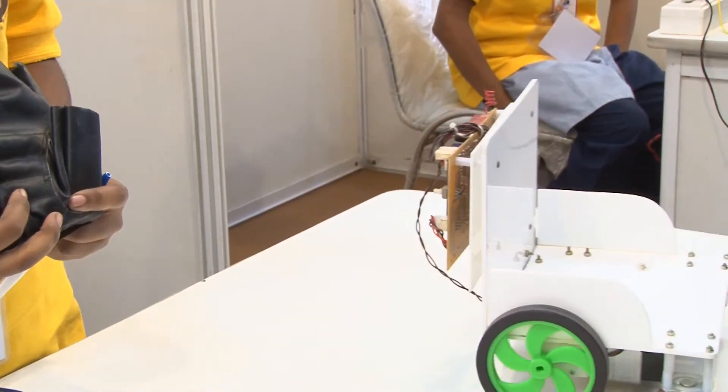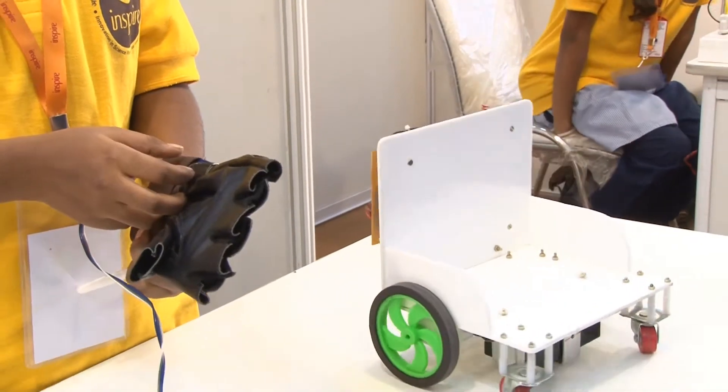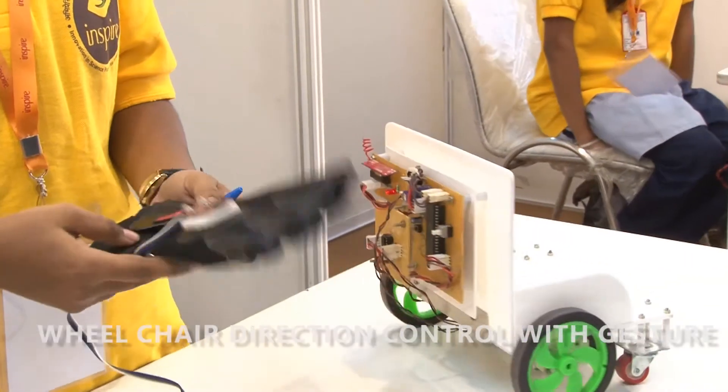The handicapped person can't move without another person's help. So the person sitting on this wheelchair can move without another person's help by giving hand directions.